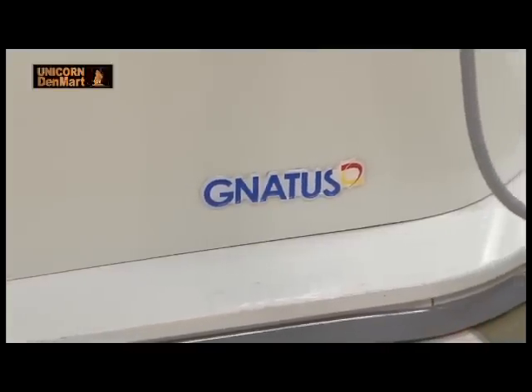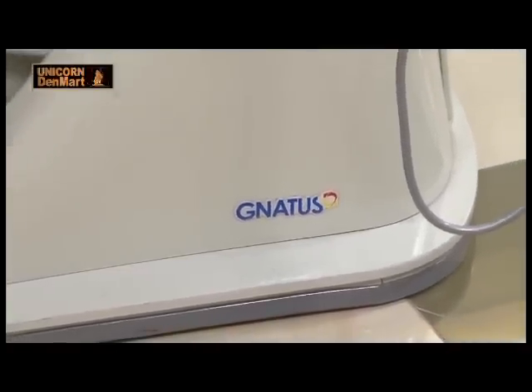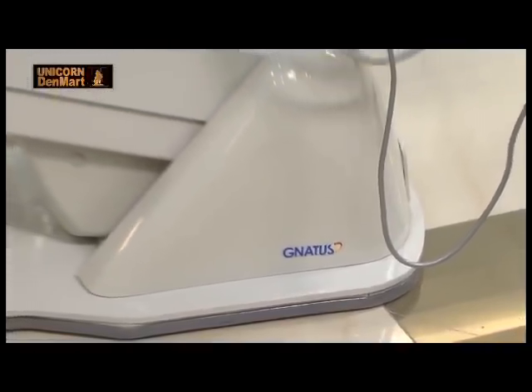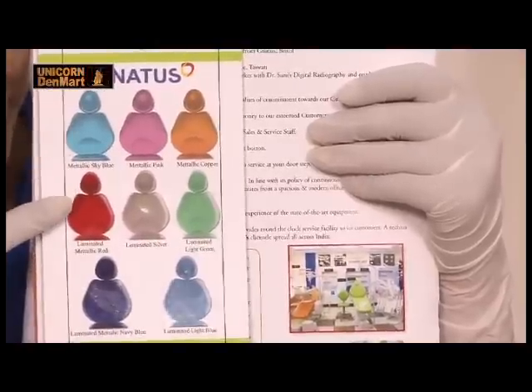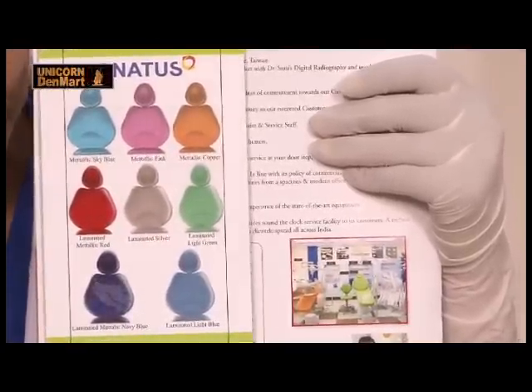This dental unit has an anti-skid rubberized base to prevent displacement of the chair during operational procedures. The chair is also provided with dew point paint on either side of the base plate, providing longer life to the chair. The chair comes in different metallic colors to suit your clinic interiors.